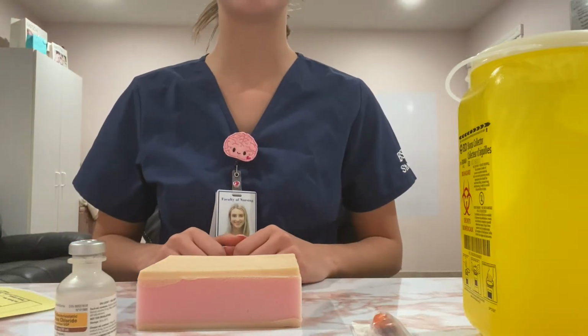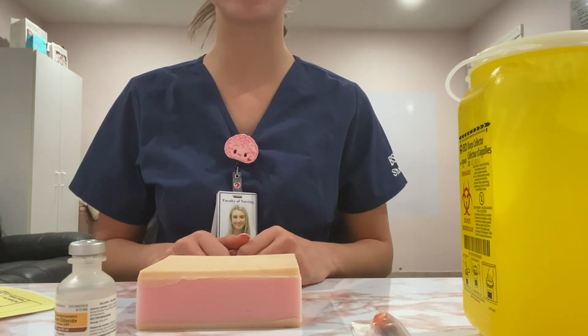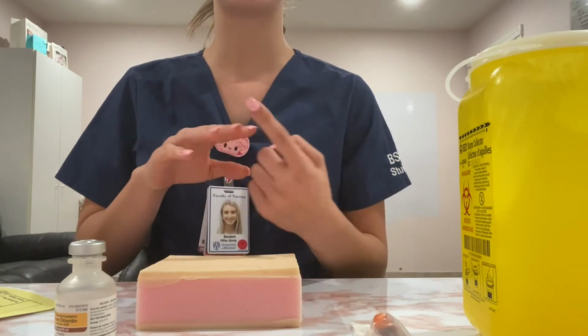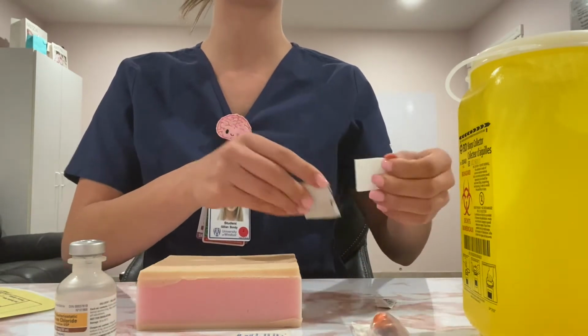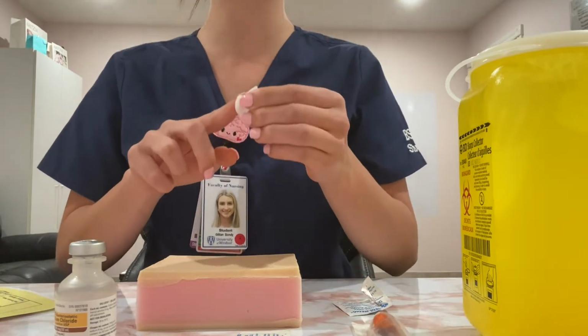So first I'm going to discuss the assessment of blood glucose. To do this, I would use an AccuCheck. So in this case, it's before the patient eats their supper. I would choose one of the 3 middle fingers and I'd use a swab. And I would swab the end of the patient's finger.